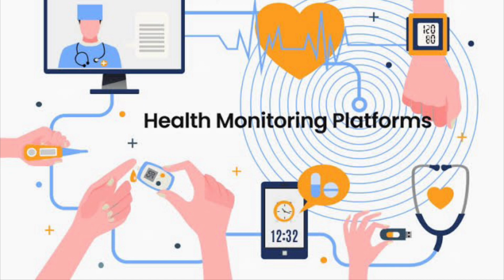Now when you compare this with intermittent vital signs monitoring, which is the practice in most of the hospitals, where nurses go intermittently, like every 4 hours, to the patient's room and check the vitals manually, this has its own benefits and demerits. The benefit naturally is that the nurse compulsorily will go and visit the patient every 4 hours. In addition to the vital signs checking, this will lead to an interaction between the patient and the nurse, and if there is any other concern that needs to be addressed or discussed, that will happen during this vital signs monitoring. It will help to establish a rapport between the patient and the nurse.